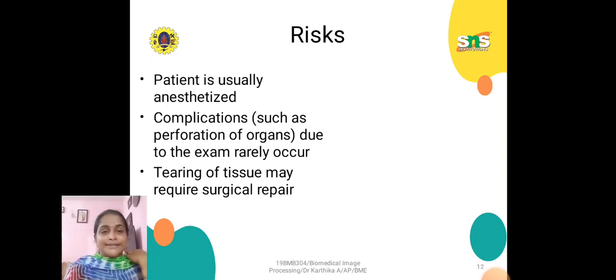And we have some risk, like the patient is usually anesthetized, and complications such as perforation of organs due to the exam rarely occur, but we have to give anesthesia to the patient very carefully, and tearing of tissue may require surgical repair too.